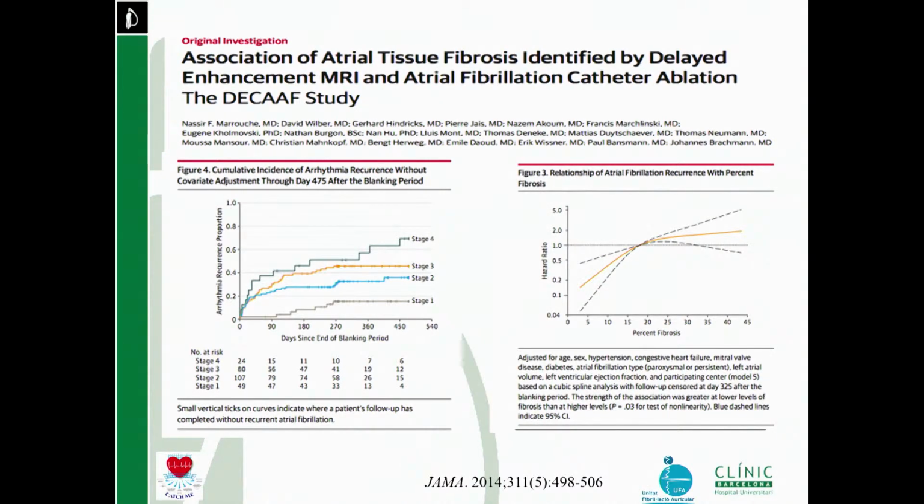And this is beautifully shown in the slide, showing that when you have the stage 4 Utah classification, then your chances to succeed with your ablation are really low.